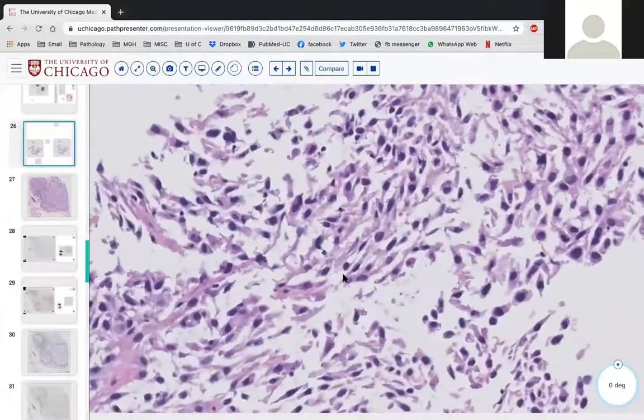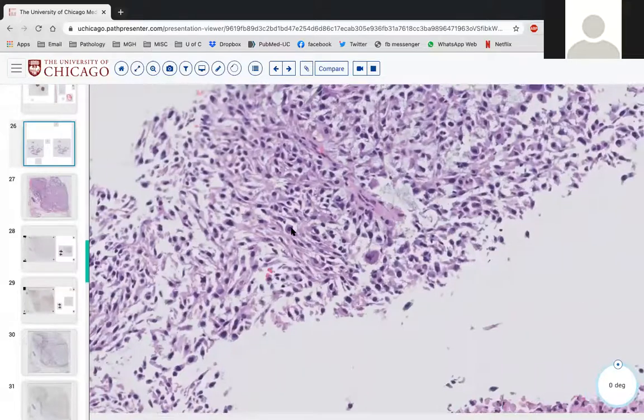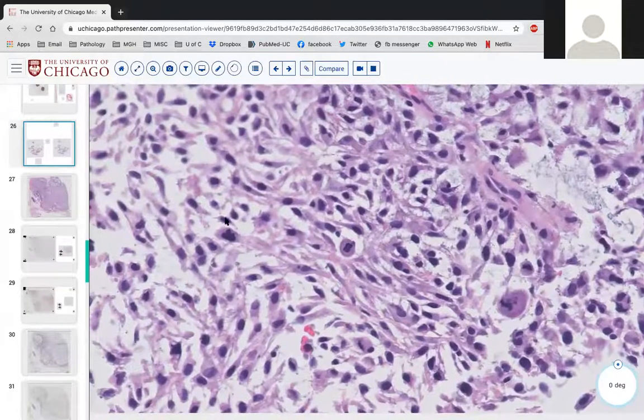Well, actually, maybe I would. They do look pretty prominently spindled out here. Yeah, I was remembering that area, maybe less so, but here, yes. And again, just dreadful looking nuclei. And I don't remember how many mitoses I counted last night, but there were quite a number of them. When you start seeing more than one in a field for salivary gland, worry.